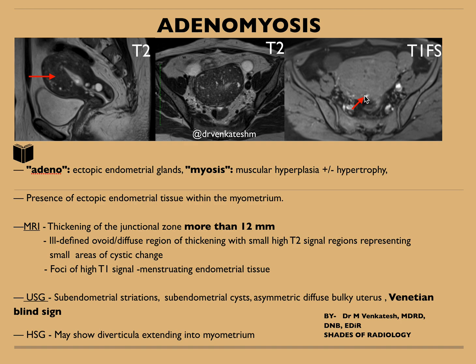The T1 fat sat image shows hyperintense foci. On ultrasound, various features may be seen: subendometrial striations, subendometrial cysts, asymmetric diffuse bulky uterus — similar to what we see on MRI — and the Venetian blind sign, which shows alternating hyper- and hypoechoic shadows posterior to the myometrium. HSG may show diverticula extending into the myometrium from the endometrial cavity.